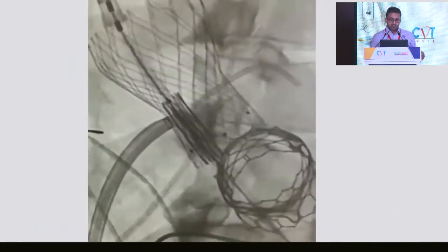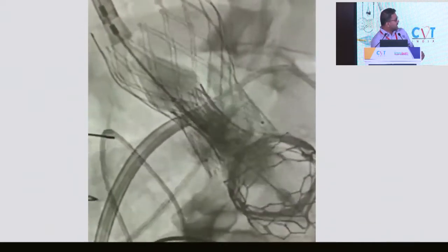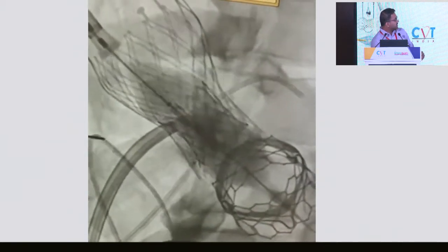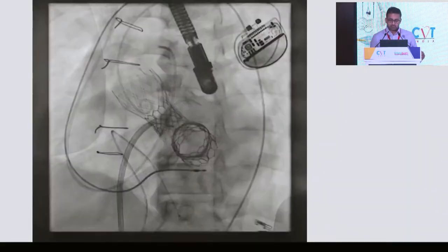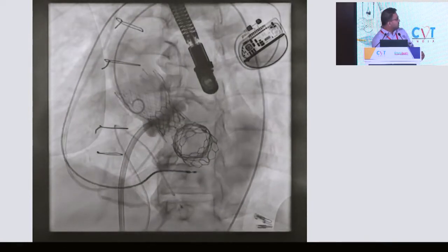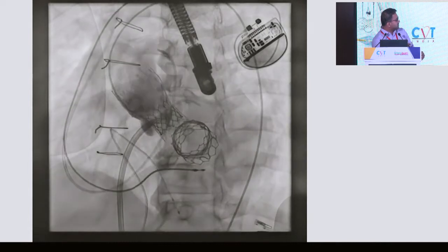Again, a close up of this. You can see here the lower border of the valve. We wanted to finish at the markers and the top exactly there, not move away. And with Sapien, the top never moves, and it's the bottom that moves up, and it ends up exactly where we want it to end. And an aortogram towards the end to clearly show that indeed the top of the valve was below the coronaries and the bottom was exactly where we want it to be.